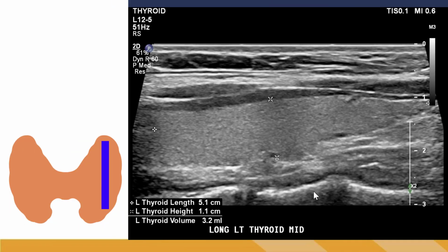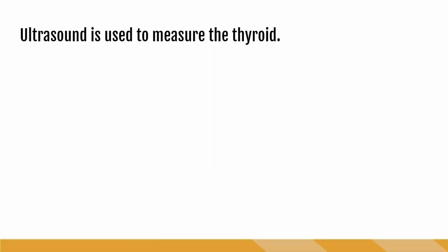As a side note, if we do have a patient who has a rather long thyroid and the superior and inferior borders are not visible using the linear transducer with the convex view on, then at this point I would switch to a curvilinear transducer just to get my measurements. We need the high frequency of the linear transducer to really evaluate the parenchyma of the tissue, but the curvilinear can offer us a bigger footprint for more accurate measurements.